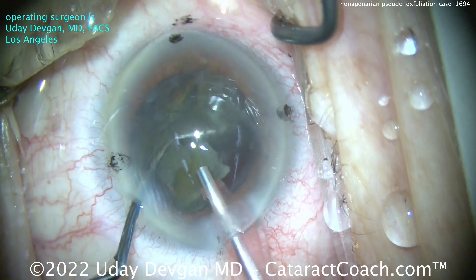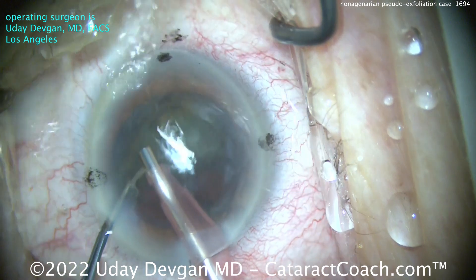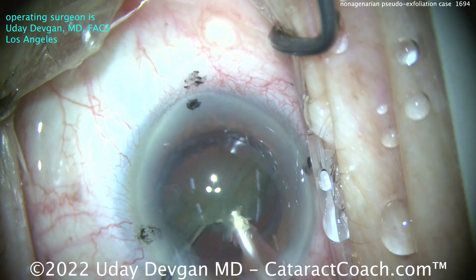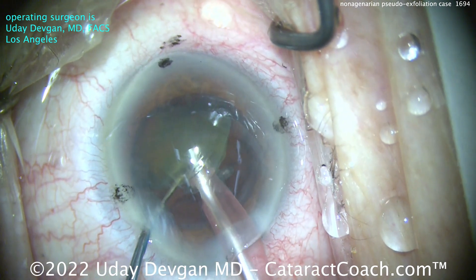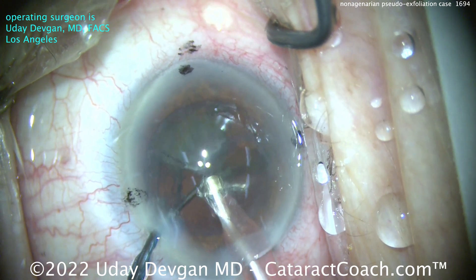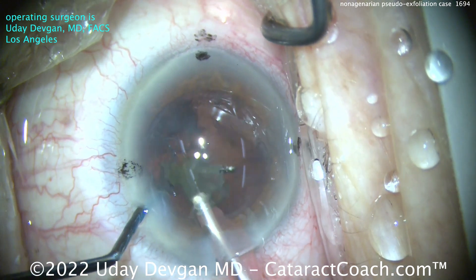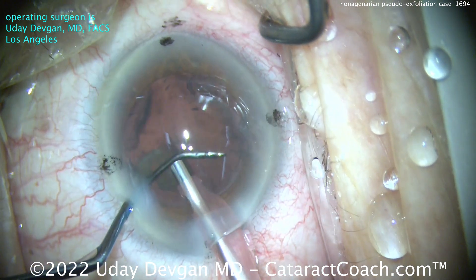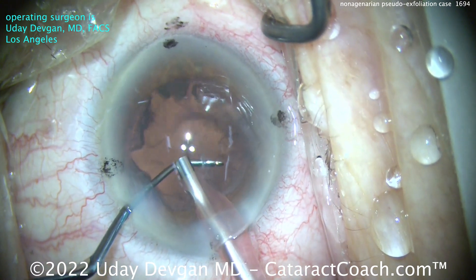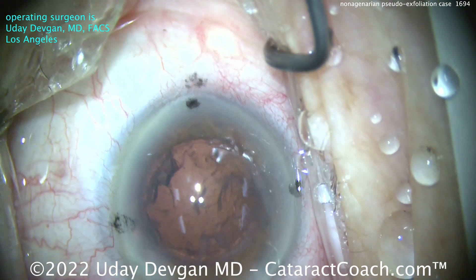This is a complete cataract case — I'm showing you from beginning to end, unedited, to show you everything that happens in an operating room with me. This was filmed in our Beverly Hills Surgery Center. Taking down this last piece of the nucleus, nice and easy. Look at the chopper position — safe position. Protect that posterior capsule. The last thing I want to do on a 90-plus-year-old is an anterior vitrectomy. Let's just be cautious, clean that up, take that last nuclear piece out. Chopper comes out. Phacoprobe comes out.